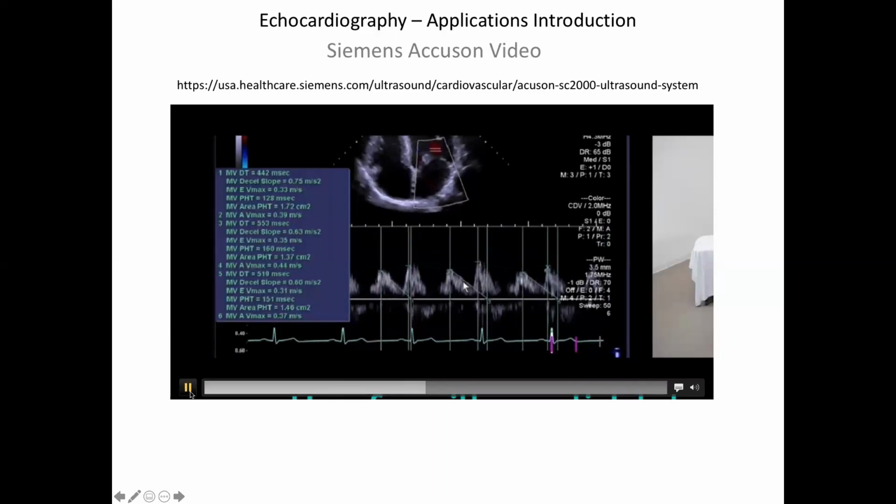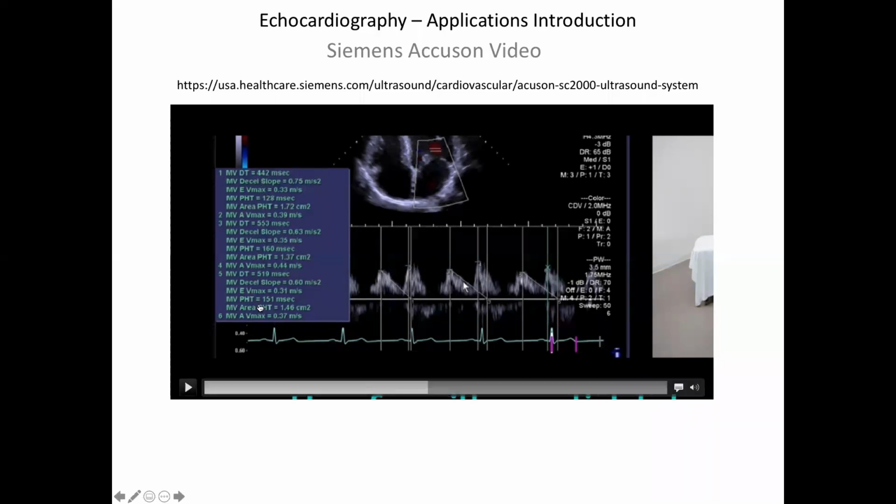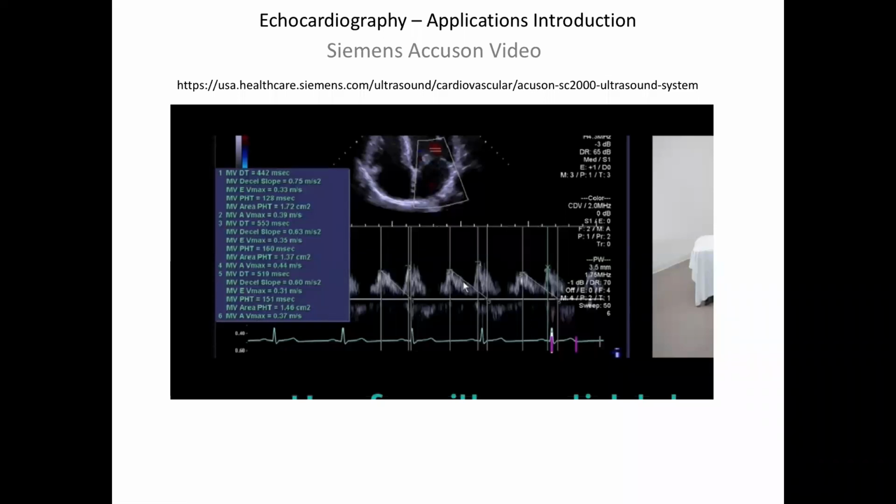So you can see now you've got this many numbers measured to quantify that object. It gets a little ridiculous, right? Maybe that's too many numbers. Maybe we're overdetermined here. But you can imagine that each one of these numbers has a number of papers written saying it's the number to measure.